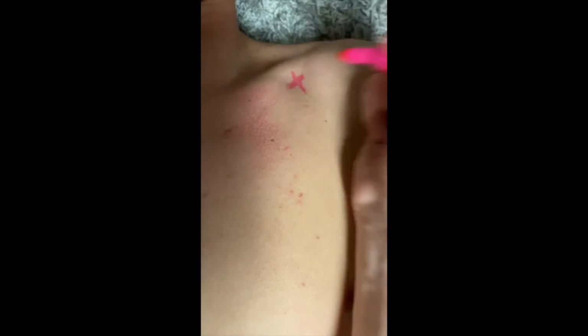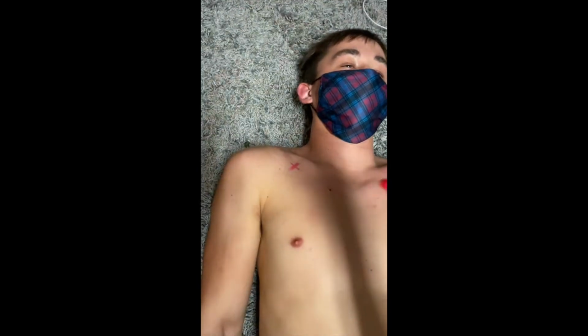All right. Now I do the same on the other side for the left arm. There we go. All right. And now for the legs, we do on the mid-clavicular line. So you can see it's like right there. And we come down at the level of the umbilicus. So we come down right here.